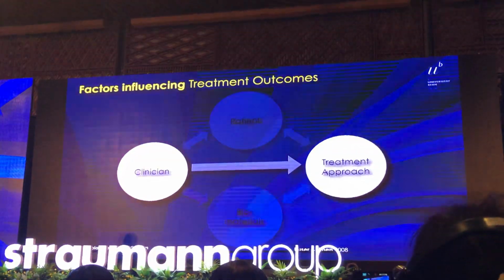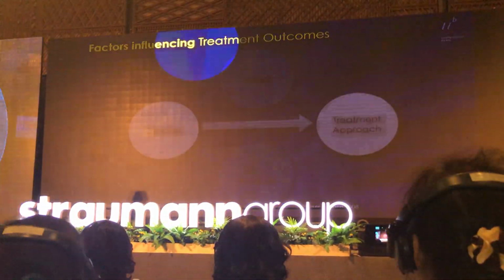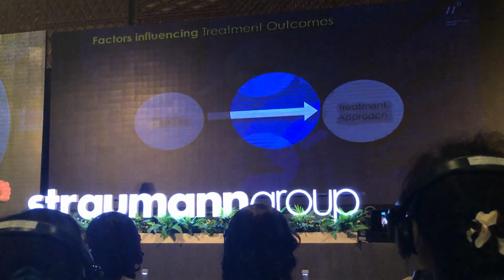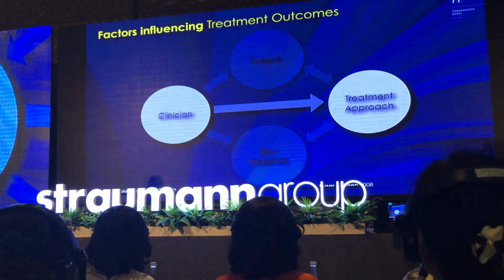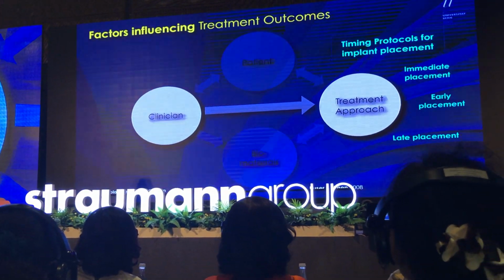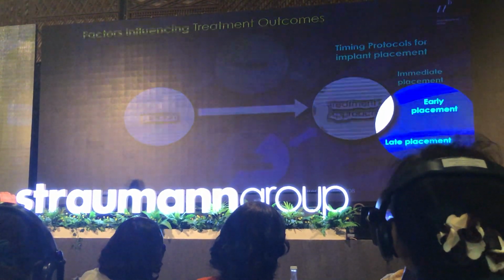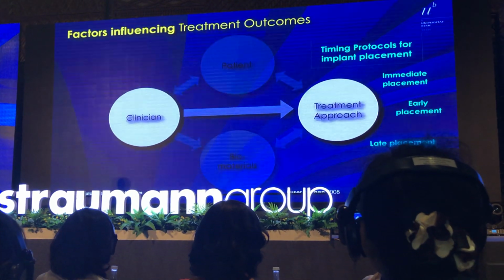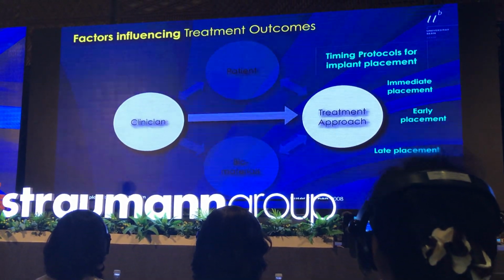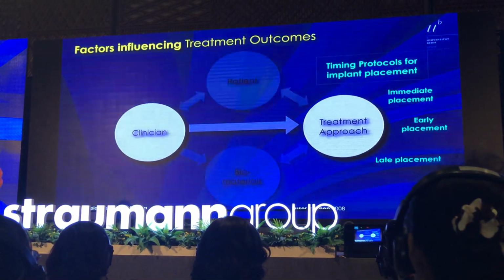So we have then the different treatment approaches. Again, it's based on the patient anatomy. Here are the risk factors, and here are the treatment approaches. And then we have different timing protocols. In the mandible, you could have an immediate placement, early placement, late placement. Same technique. Are we using immediate implants in the mandible? Never, because that doesn't work.